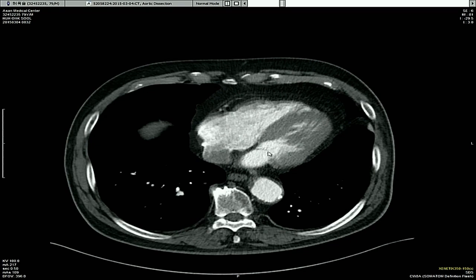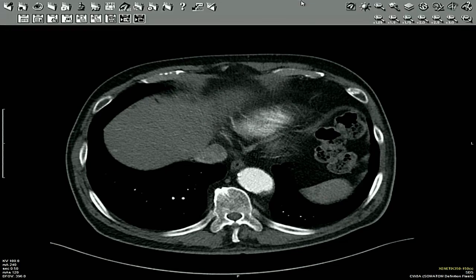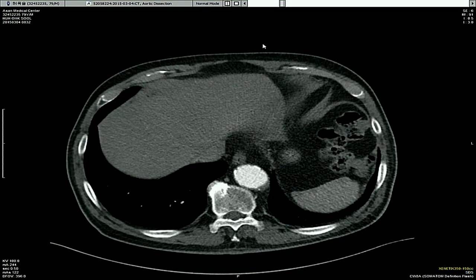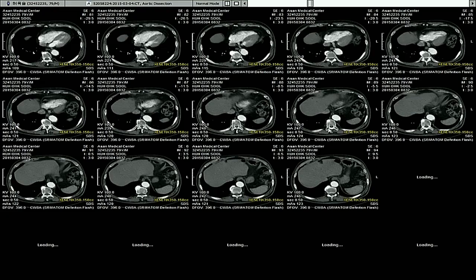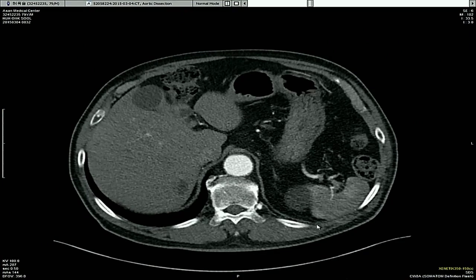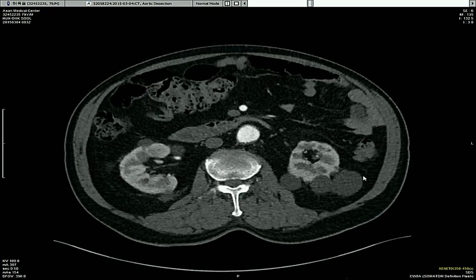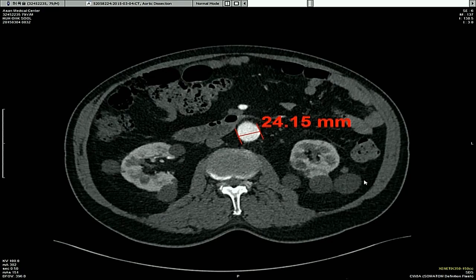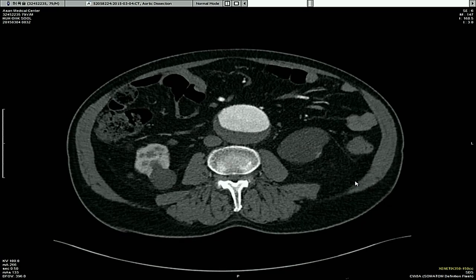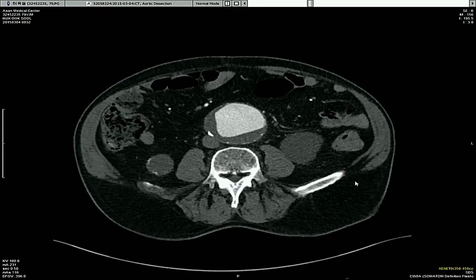If we want to treat that region, we need a hybrid procedure. So we want to treat the aortic aneurysm today. Next. Yeah, good. Let's see the iliacs here. Okay. So you have an elongated, somewhat angulated aortic neck, but it's certainly one that's doable. And very large AAA. Partial thrombus. No doubt about that.